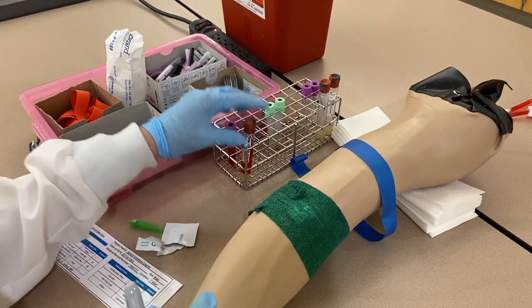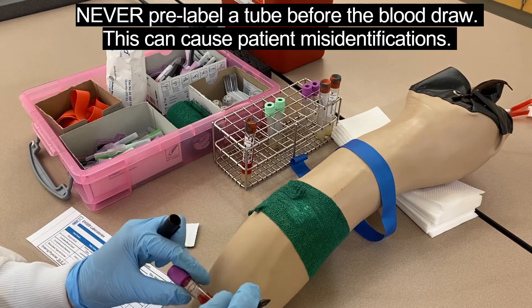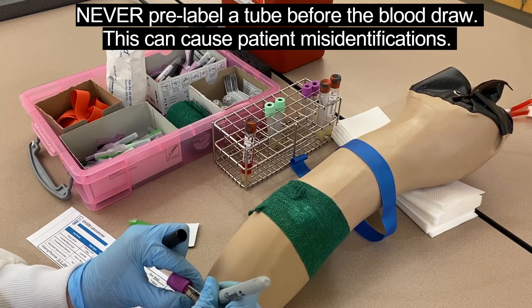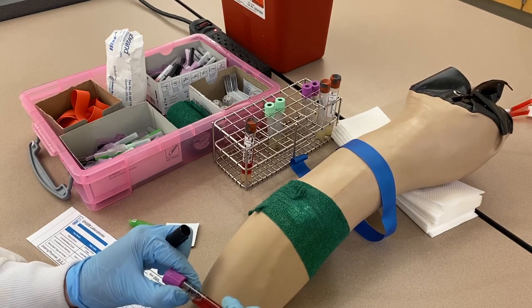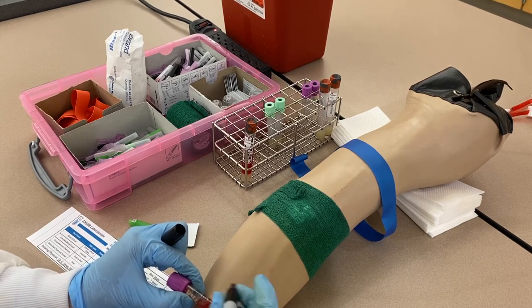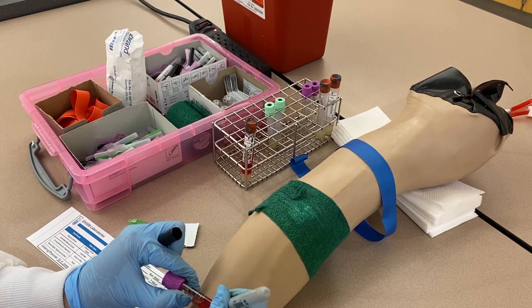Always label before you leave the patient's bedside, and always label after the tube is filled — never label an empty tube. If you label tubes before a draw and can't get a sample, you might forget those labeled tubes and take them to another patient's room. You could accidentally fill a pre-labeled tube with someone else's blood, creating a patient misidentification error that you might not catch, leading to serious problems. Always label tubes after they're filled and at the patient's bedside.